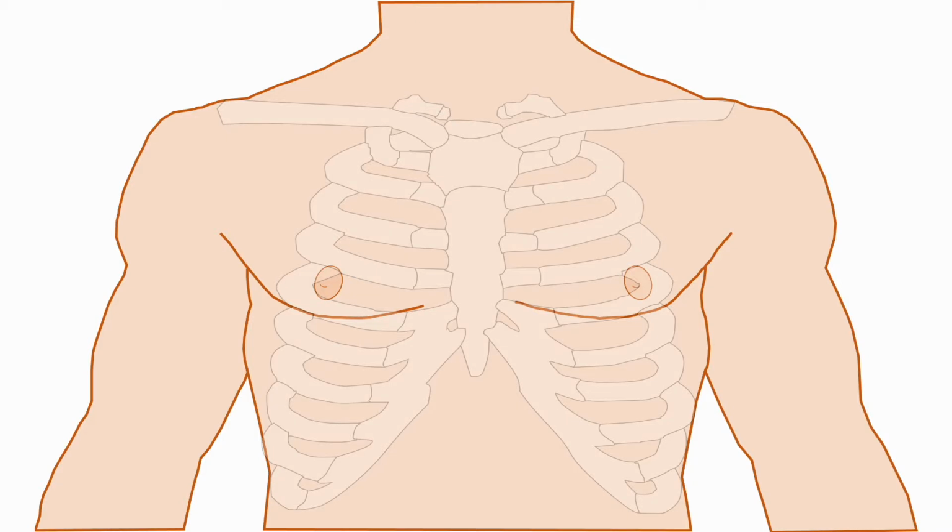Skin should be cleaned and free of hair. Clean the areas with an alcohol prep pad. A clean surgical razor should be used to remove any excess body hair as it will impede contact. If the patient is wet, bloody, or soiled, take time to clean and dry the areas you'll need to place the EKG.